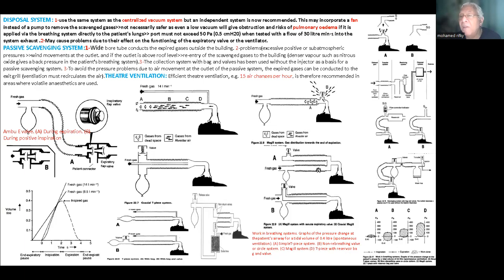And then when we have a situation of contamination, or we want to minimize the cross infection, we can remove this part, and then we can of course sterilize this area. For the thing that I missed, to assure that the system has a proper assembly, these valves may be damaged by sterilization if they are plastic.